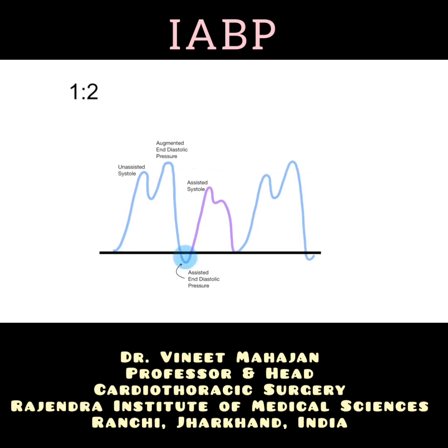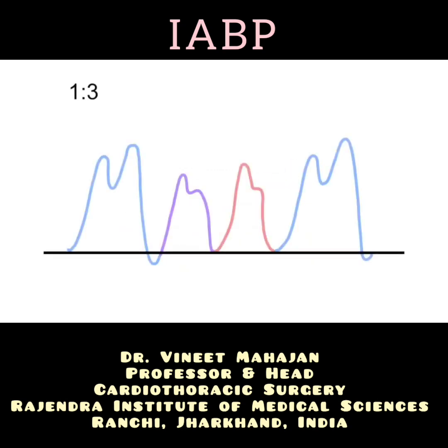Realize that afterload reduction truly occurs when the assisted end diastolic pressure falls below the baseline end diastolic pressure, a phenomenon that can only be appreciated when the balloon pump timing is on 1 to 2 or 1 to 3. 1 to 3 timing refers to balloon inflation every third heartbeat and is mainly utilized for weaning. As you can see, we have the augmented end diastolic pressure, the assisted systole, and the unassisted systole. In addition, we see the balloon pump beat dropping below the baseline, signifying that afterload reduction is occurring.